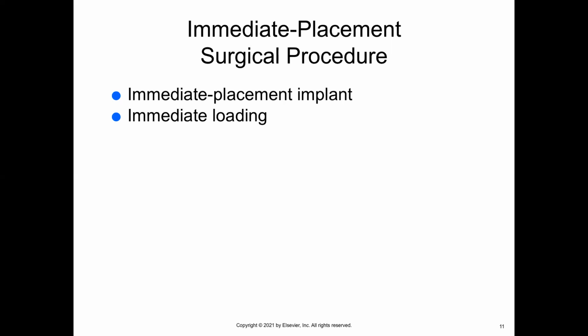There's an access hole on the top of the occlusal that is filled with resin material once the implant is screwed into place. Cement retained implant crowns do not come off easily. If the cement is not cleaned off properly, the remnants left behind could cause peri-implantitis and loss of the implant.